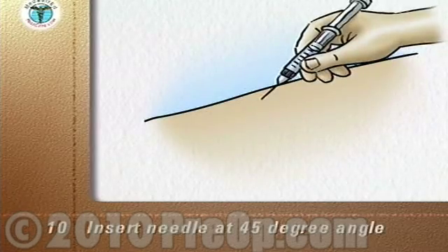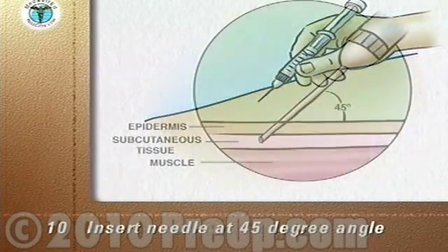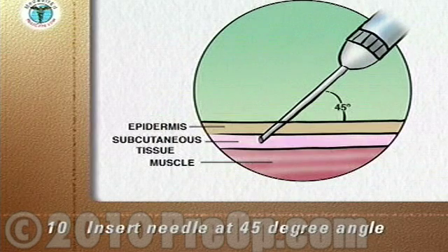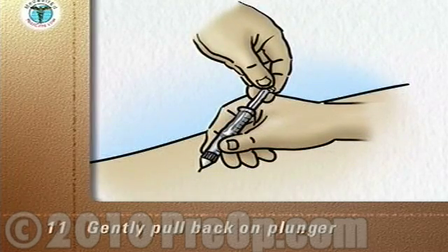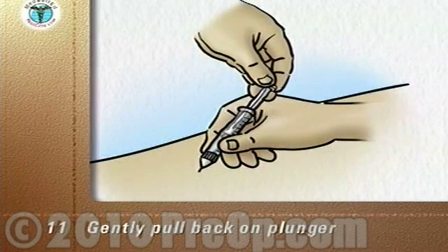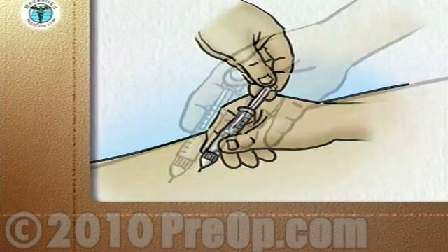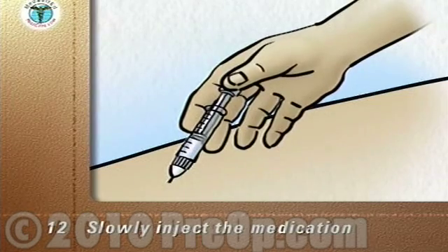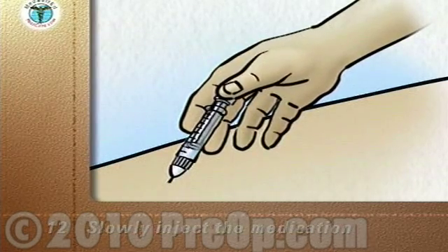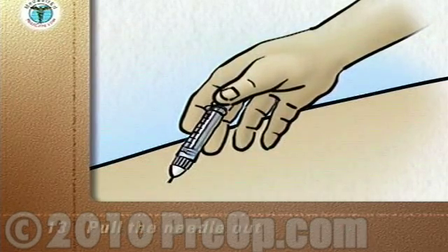Insert the needle through the skin at a 45-degree angle so that the tip of the needle is under the skin and above the muscle layer. Gently pull back on the plunger to make sure that the tip of the needle is not in a blood vessel, and then slowly inject the medication. When all the medication is injected, pull the needle out.